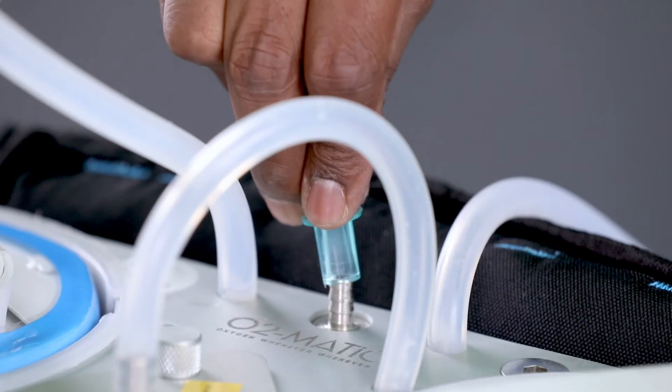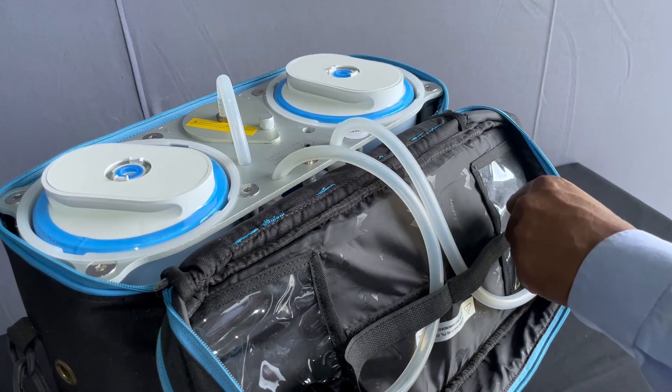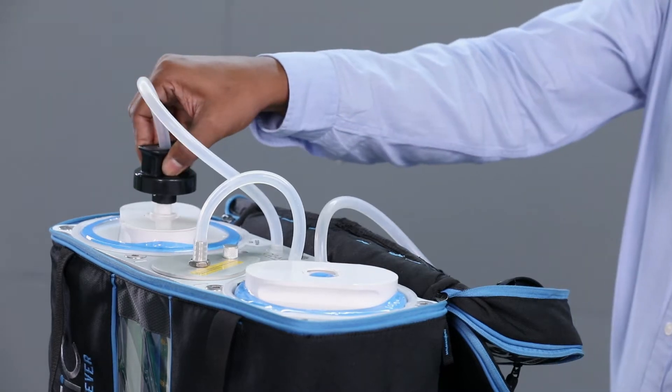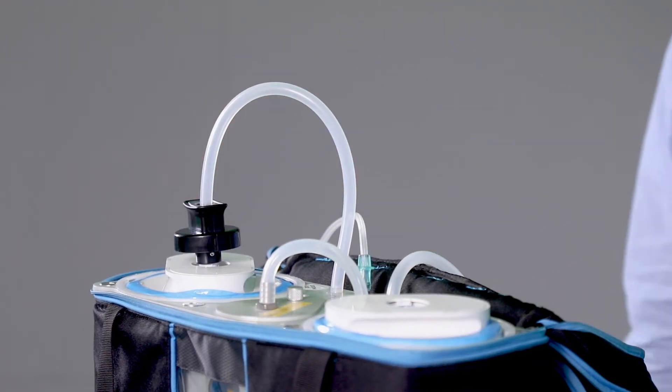Attach the mask to the oxygen outlet port. Detach the twist trigger from the Velcro holding strap. Position and lock the twist trigger into the cartridge. Trigger the cartridge by rotating the twist trigger 90 degrees clockwise.